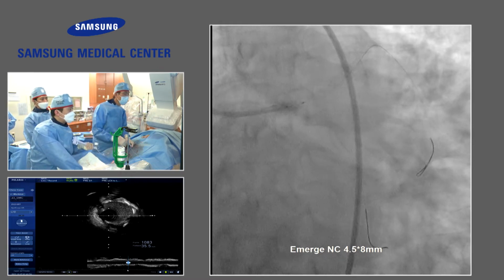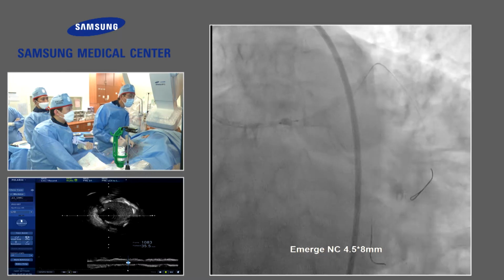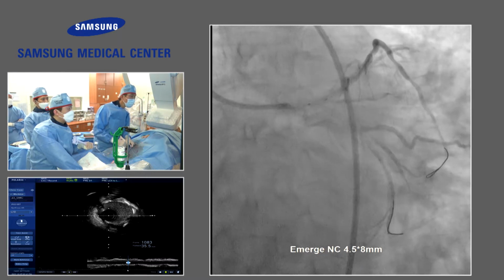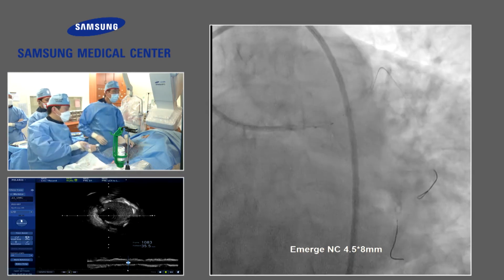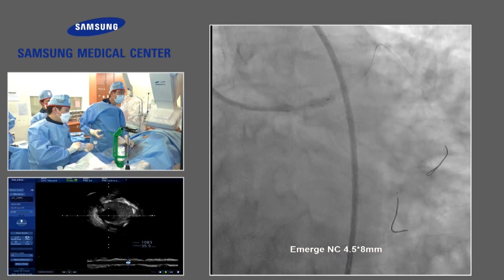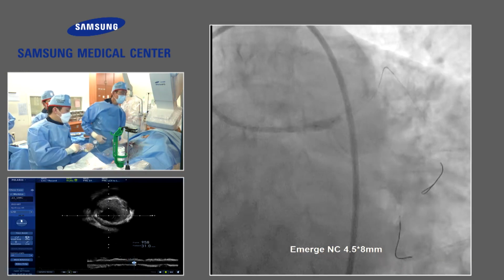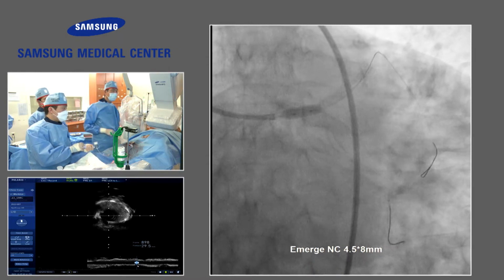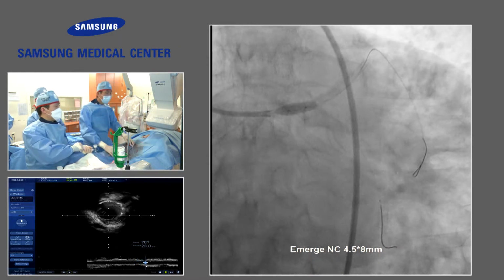POT is too proximal. Gentle touch and just attach it. Test. Okay. Inflation. 4. Slowly, it is slipping. 4, 8, 10, 14. The balloon has slipped already. Okay, deflation.